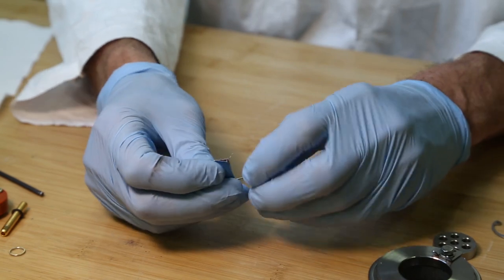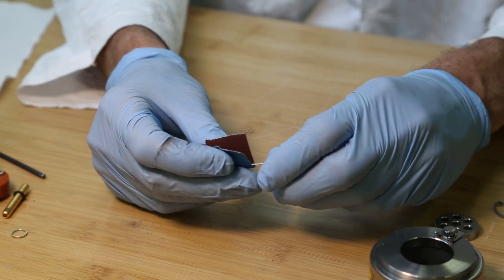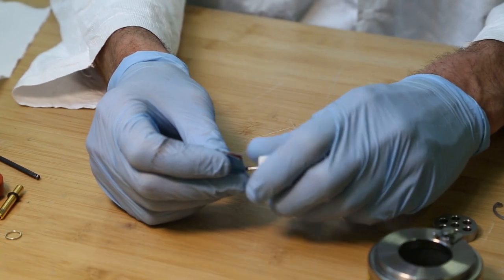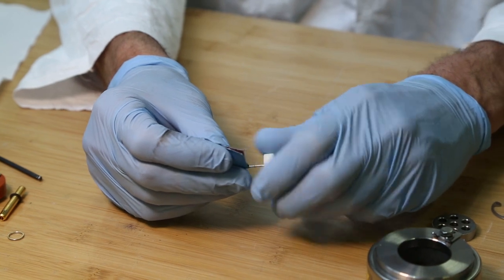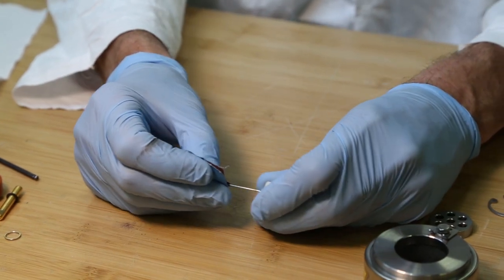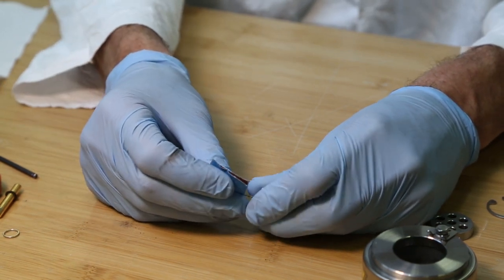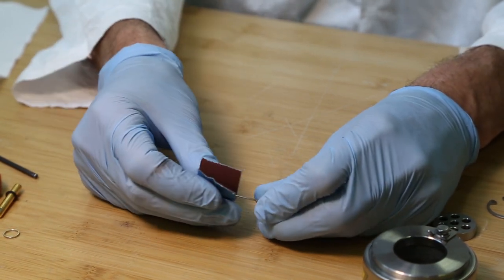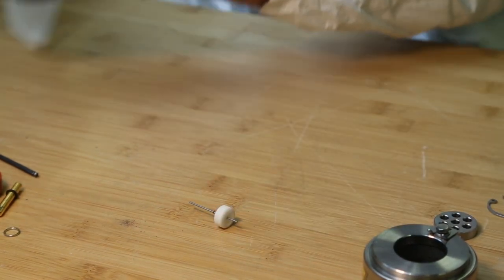We'll just take some sandpaper here and scrub the end of the pin, being careful not to disturb the clip. And again, we want it to be basically shiny and steel-like without any discoloration. That's that.